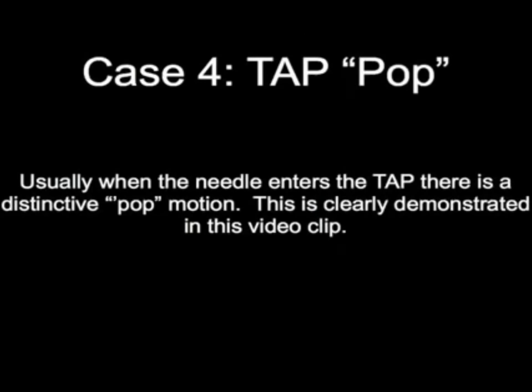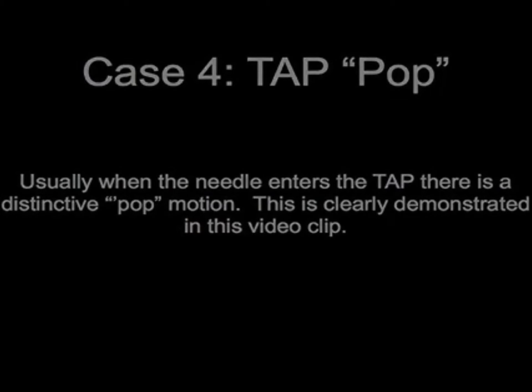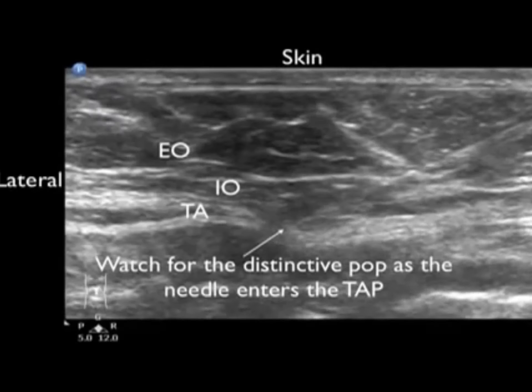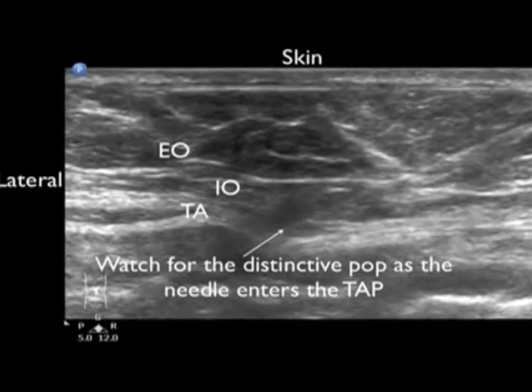Case 4. Usually when the needle enters the TAP plane, there is a distinctive popping sensation. This is demonstrated here. And here is a repeat look.